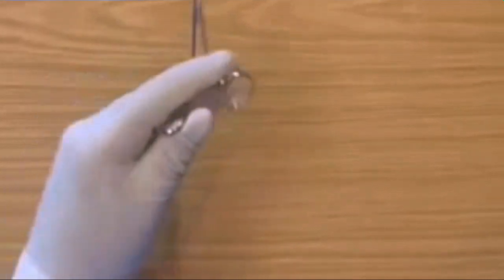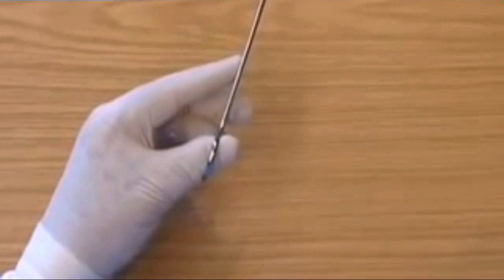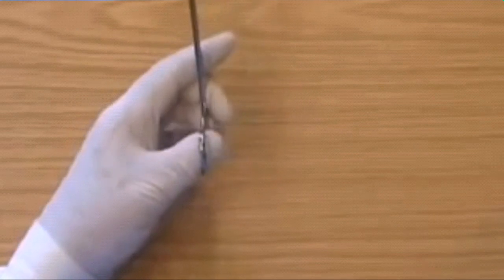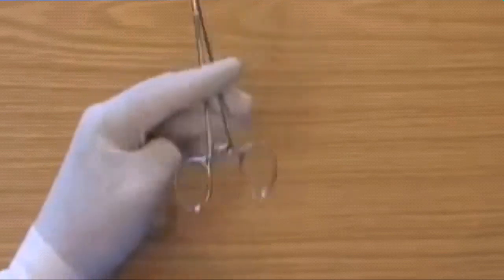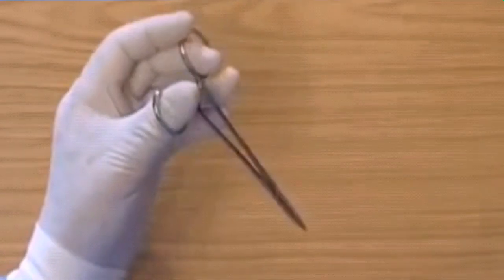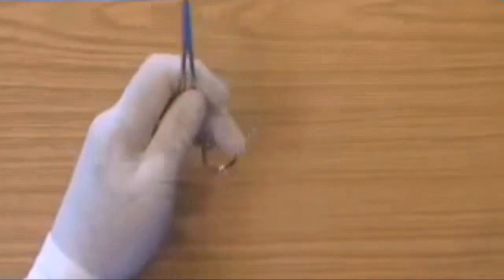Changing to the standard grip. Changing to the palm grip. Changing to the reverse grip. And going back to the standard grip.